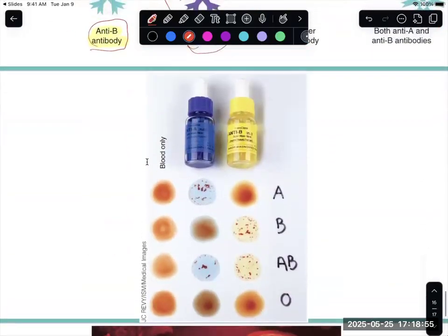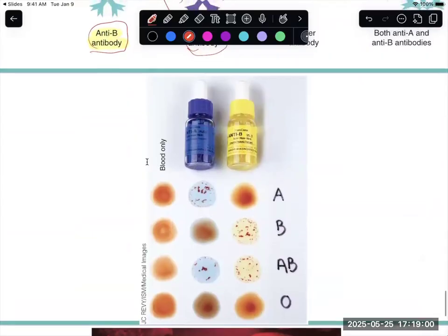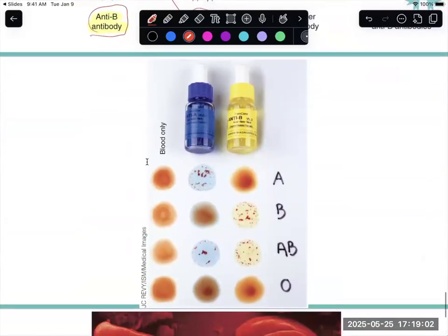So when we blood type different blood, how we tell what type of blood something is, we use different chemicals to come in and mix blood together. So if somebody were to be given an anti-A, if that blood clumps, that tells us it's A. If somebody was given anti-B, that B blood clumps up, that's what you get.